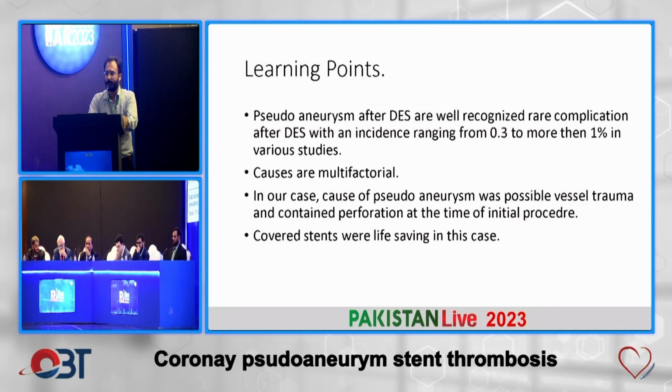to more than 1%. The causes are multifactorial, but in our case, the cause of pseudoaneurysm was possibility of vessel trauma that was due to the overstretching of the vessel during the index procedure and contained perforation that extended further to form a pseudoaneurysm. And covered stents were life-saving in this procedure. Thank you so much.